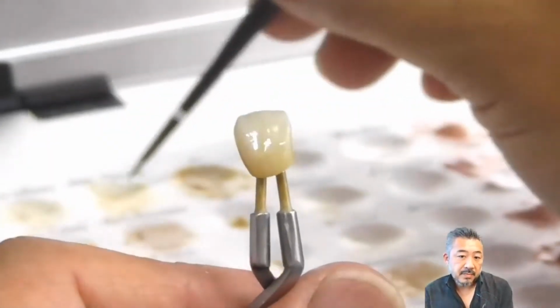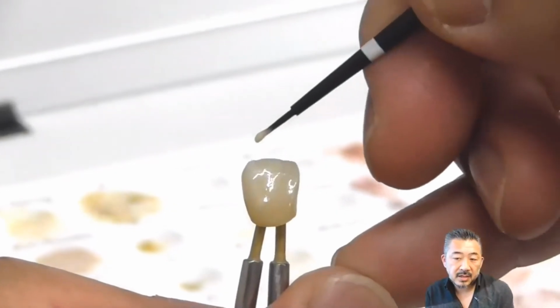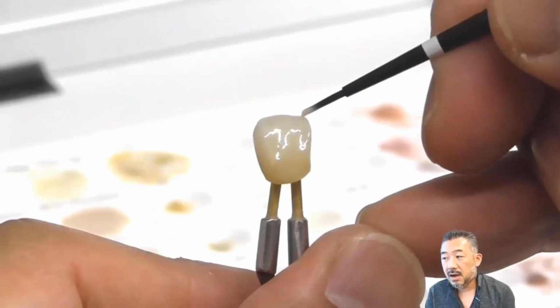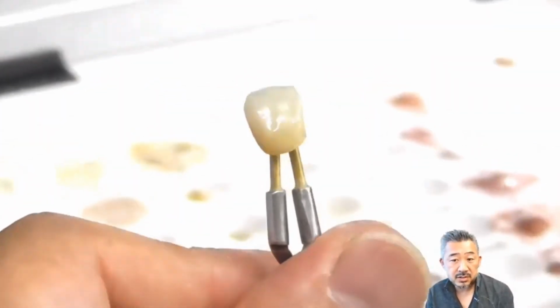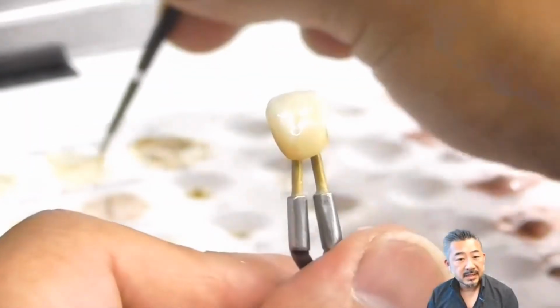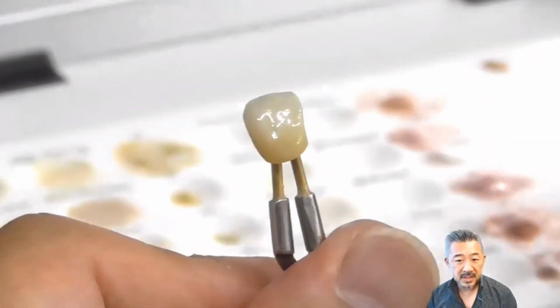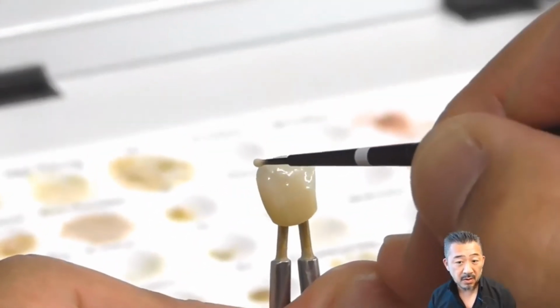I use a medium opaque paste and apply it with a fine brush to the incisal edge and the marginal edges so as to outline the crown. As a result, you can emphasize the natural transparency and the crown outline. It may be hard to see in this video, sorry, but I use this paste for most cases of monolithic zirconia crowns because the overall texture is better.